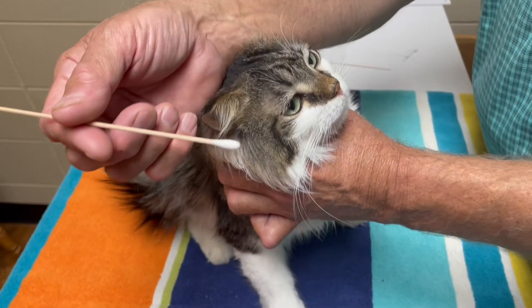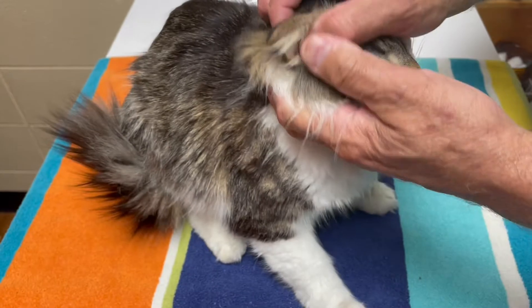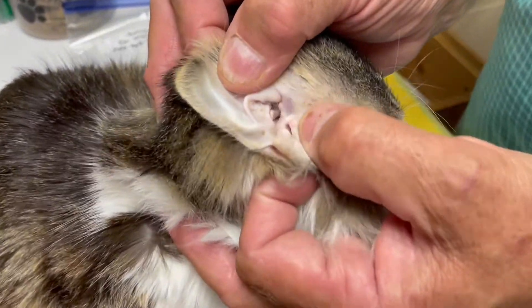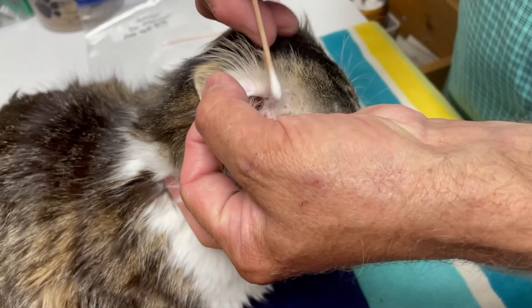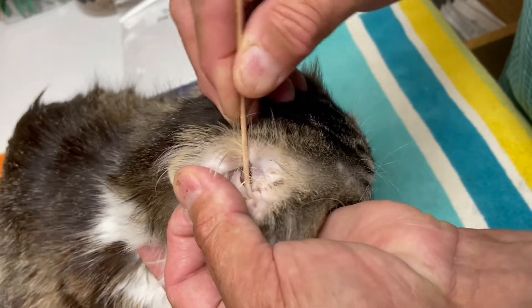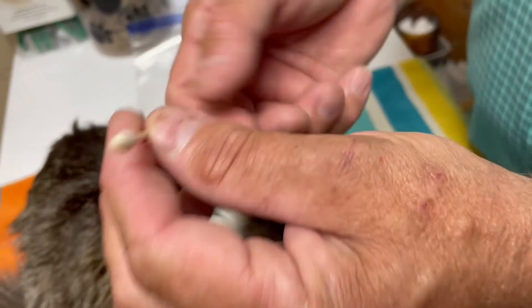We're going to start by taking our q-tip. Ours looks a little bit different than what you're going to find at the store, but whatever you have at your house will work perfectly. Dr. Molitor is going to gently open up Junior's ear to expose his ear canal. Take that q-tip and gently rub it back and forth in the ear canal. Make sure you never lose sight of the tip of the q-tip.